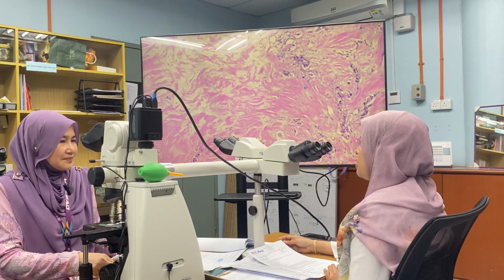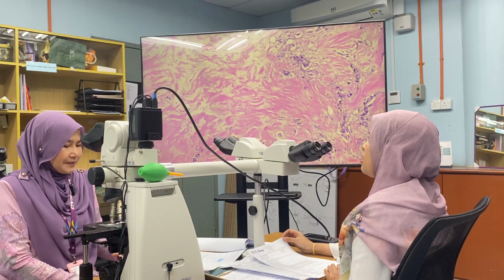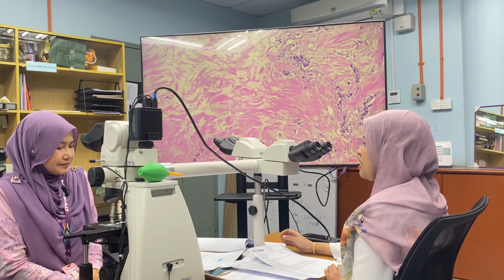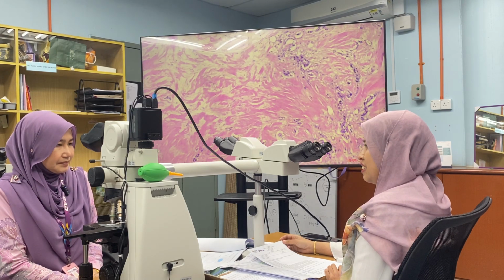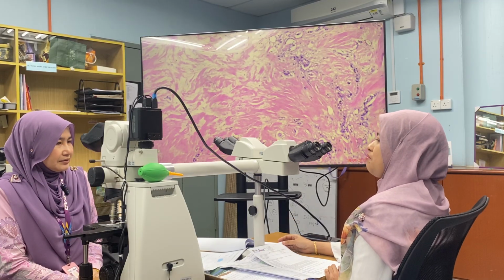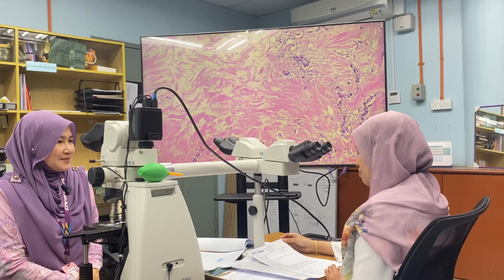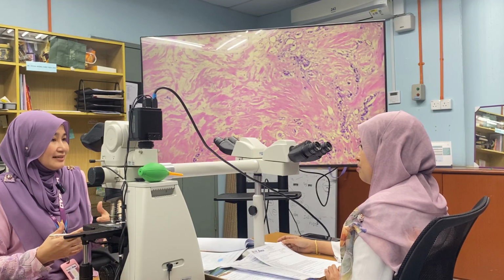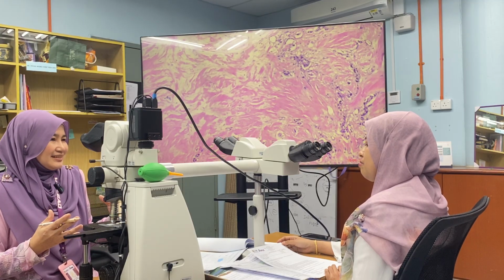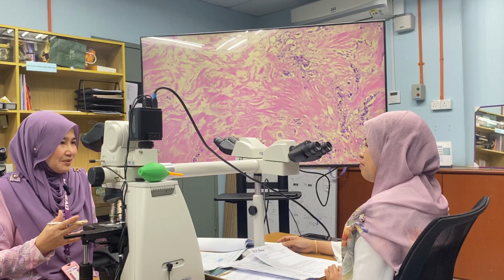Chemo-related changes: the cell can have vacuolated cytoplasm, nucleomegaly, coarse chromatin, and also be degenerated, like necrotic. All right. Myoepithelial. This is all the things that you need to describe in your report. So we know that there is some response to the chemotherapy with those changes. So we can assess the chemo response, right?